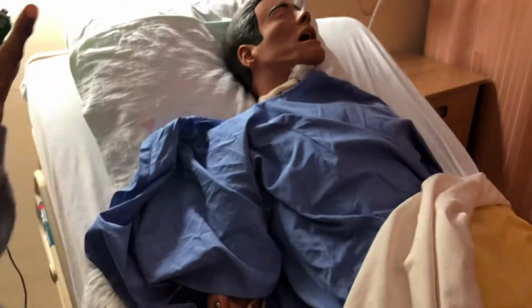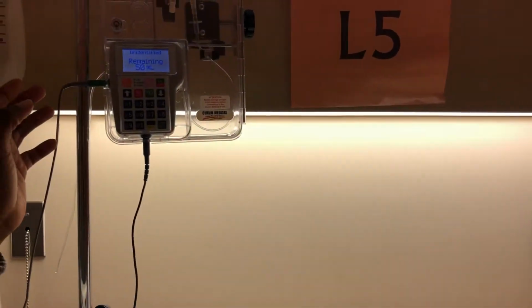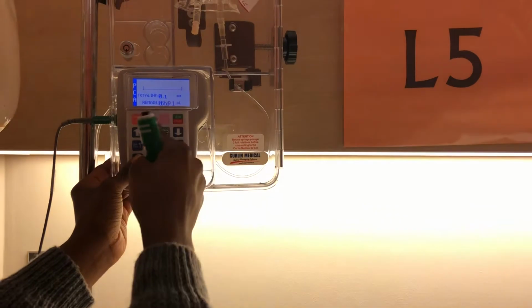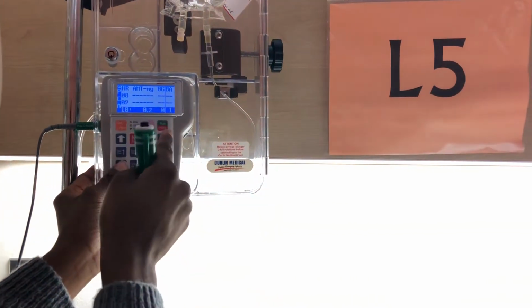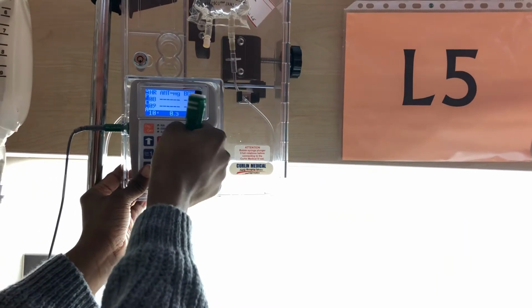So for the sake of this video, I'm just gonna demonstrate how to. When you press it, you are going to hear that 2 beep, and then if you press 5, you will see this. So the patient has requested 1 but has gotten just 0. So now leave this here.